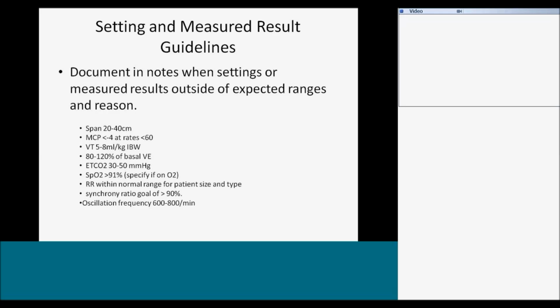Some patients require a little bit more than 30 centimeters. Some patients require a little bit less than 30 centimeters. Some will ventilate fine on a 12 centimeter span, but those are rare patients, and they have very flexible chest walls and very good lung compliance. Some patients will take 44 or 50 centimeters of span to give them the right tidal volume.